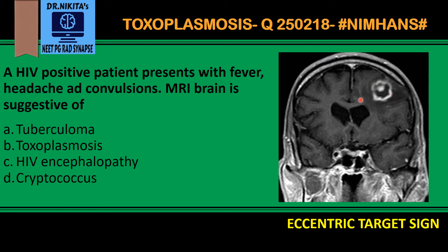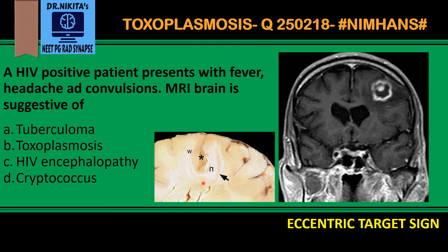The surrounding black area is the edema. This eccentric enhancement has been called the eccentric target sign, which is very specific for toxoplasmosis. This is the abscess of toxoplasmosis, which has necrosis at its center, and the wall of the abscess enhances due to the histiocytic response, while the necrosis does not enhance because it is dead tissue.